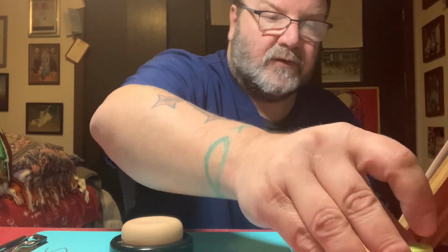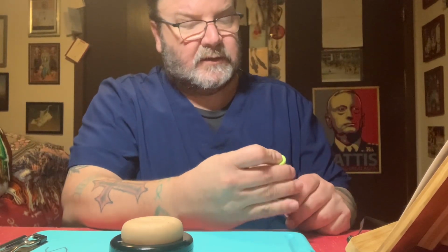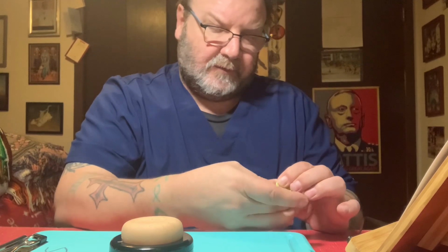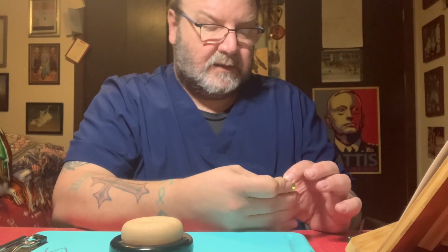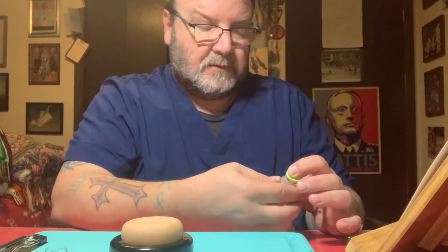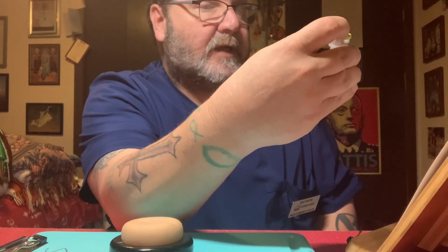So I'm going to withdraw my medication. Not cracked, not cloudy, not chipped. Mantu expiration date is... there's the expiration date, 01 of 24. So yeah, Mantu, that's my second check.